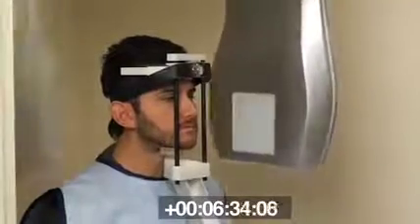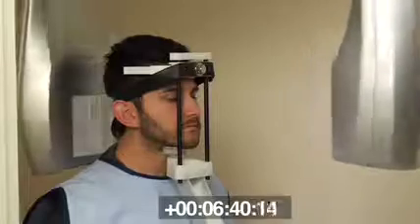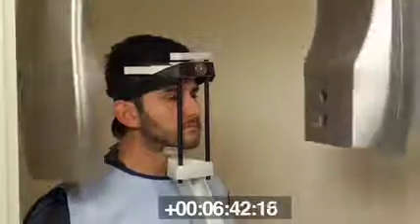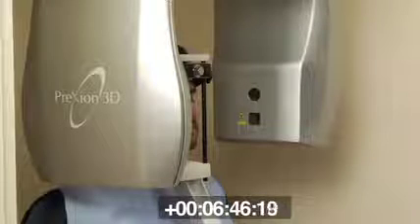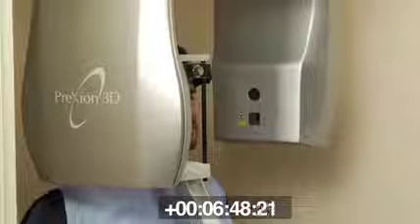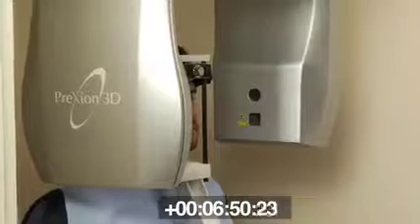It's a 19-second scan, and as it goes around, it's taking a full volume, not a slice, but actually it's almost like a photo at each of the 512 positions as it goes around the patient here. And it is just about complete. It's done right now. And at this point, the computer will say to discharge the patient, so we'll click OK, and I'll go in and discharge our patient.